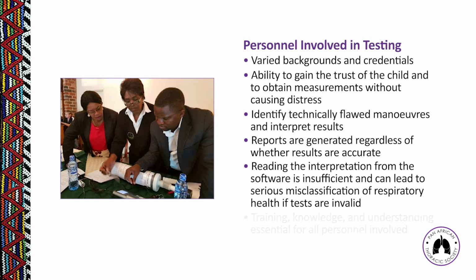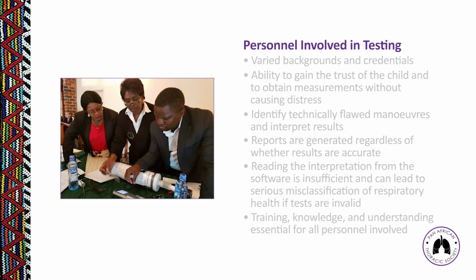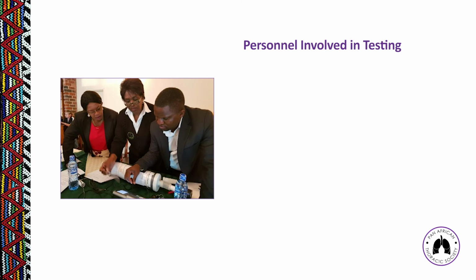You need to be knowledgeable and you need to have a good understanding of the pitfalls that occur during the spirometry test itself, which can affect the overall test result and the interpretation of that test result. And this is essential for all personnel who are involved in pediatric spirometry testing. Just a little bit more information about the people.